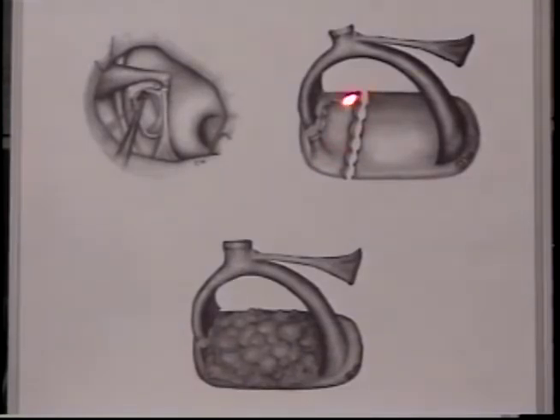What we do is take the laser and make 2 cuts, one right across the footplate and one right across the stirrup, the anterior crus. What that does is it separates the mobile portion from the fixed portion of the stapes and preserves the patient's tendons, the stapedius tendon, and actually preserves most of the patient's normal stapes. The hearing then becomes normal, and we then take a small piece of fat adipose tissue and place it over this opening, and the patient leaves the hospital.